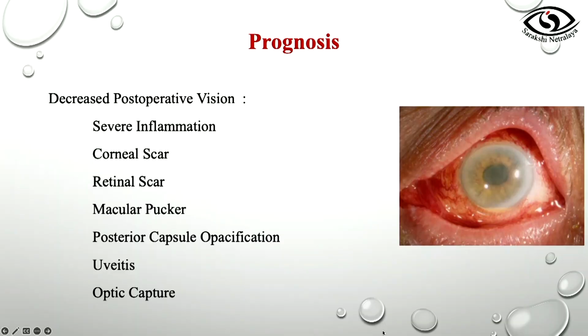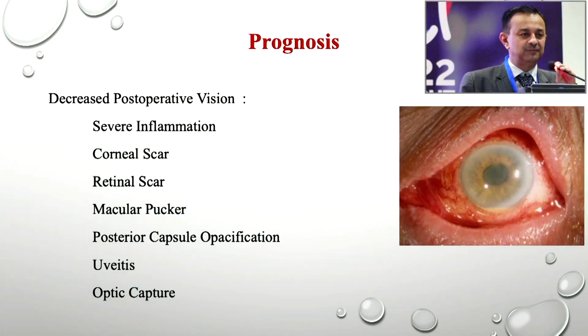Yeah. So friends, traumatic cataract is a gamut of pictures put together. Remember, many a time you are fooled by a simple white looking cataract which will be obvious, but many a time it is associated with posterior segment and other morbidities. So preferably it should be done in a setting where you have a vitreoretinal surgeon sharing the theater with you.